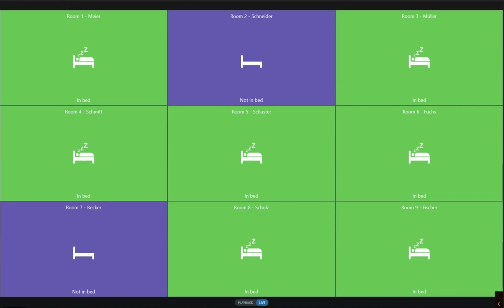as a smart sensor and delivers to the MOBOTIX Hub status information on whether the person in elderly care or in a hospital is in the bed, is not in the bed, or has fallen down and is lying on the ground. The functionality is quite simple. As you can see, we are not working here with any kind of live images. We're only presenting to the nursing staff the status information without showing the live screen.